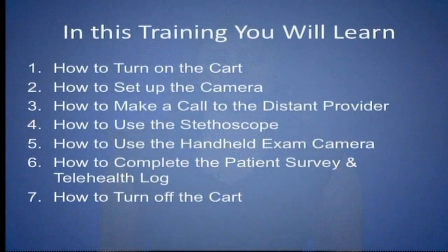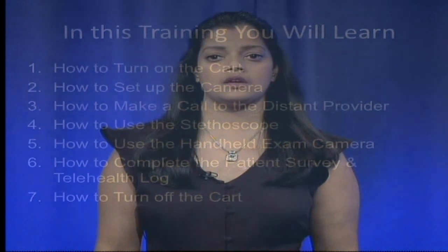This is a basic training to learn how to operate the CART to do telemedicine visits, telehealth visits, and video conferencing. In this training, you will learn how to turn on the CART, how to set up the camera, how to make a call to the distant provider, how to use the stethoscope, how to use the handheld camera, how to complete the patient survey and telehealth log, and finally, how to turn off the CART.